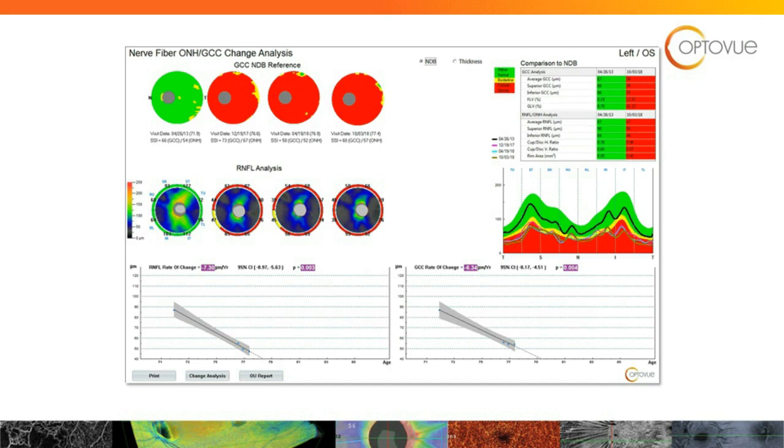That is one that we always print out and put in our EHR. But oftentimes I'm also interfacing with the OCT information within the software program itself. So I do it both ways. Those reports are available, and I can't tell you exactly how to bring those up right now, but I'm sure your rep would be able to help you with that.